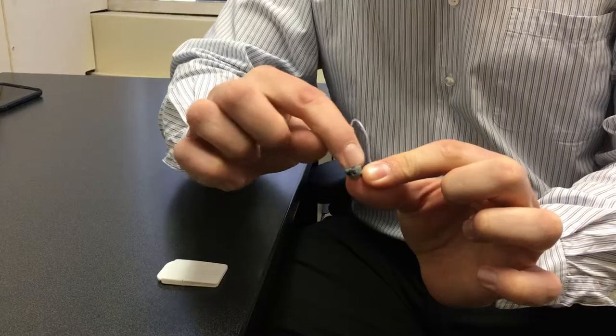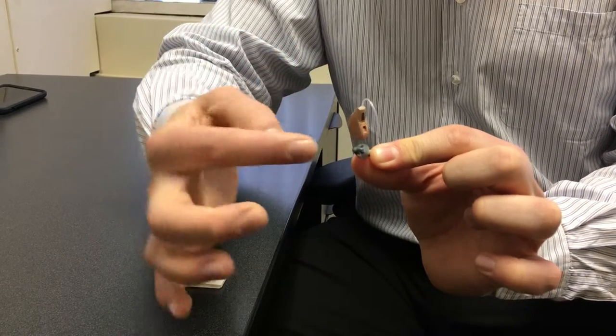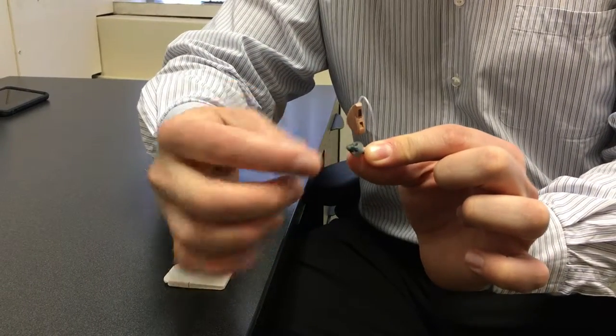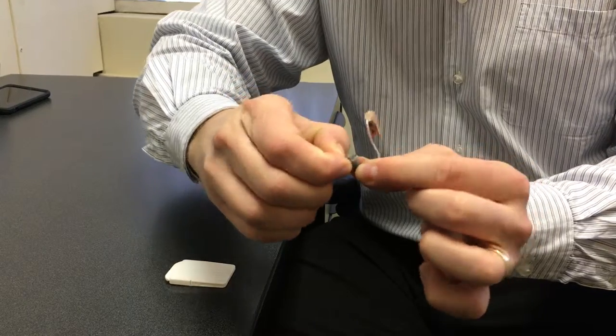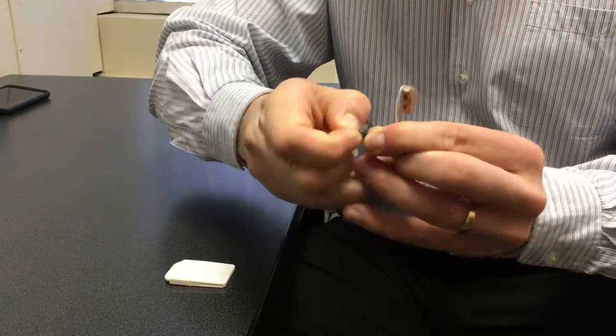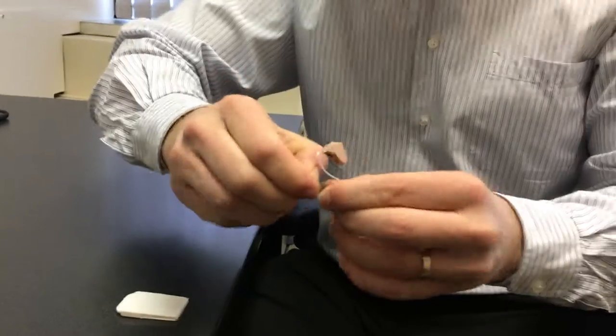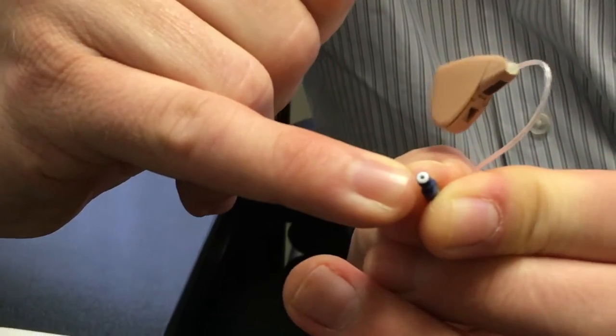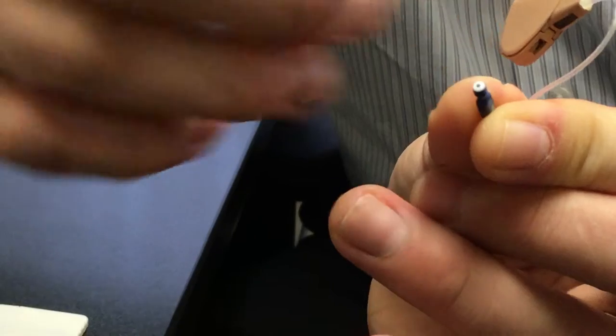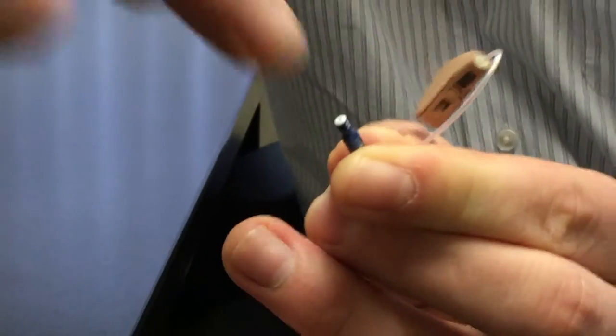So this is the part where the sound comes out and this rubber thing is a dome. Underneath that dome is a little filter, so if we pop that dome off, underneath is a little filter and it's just a little screen and it traps wax before it gets into the hearing aid.